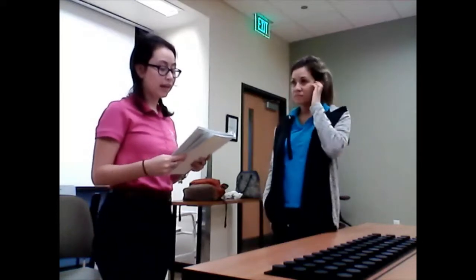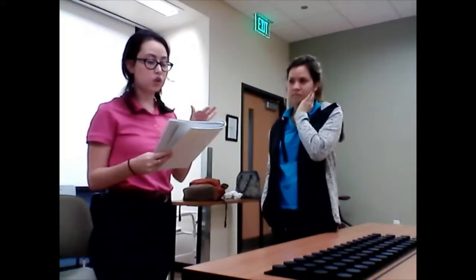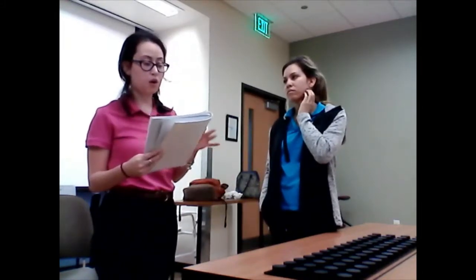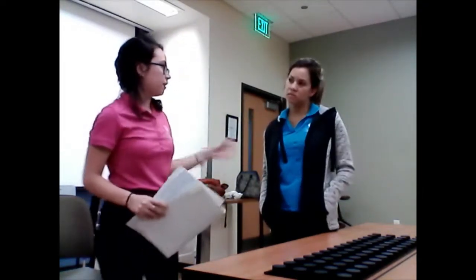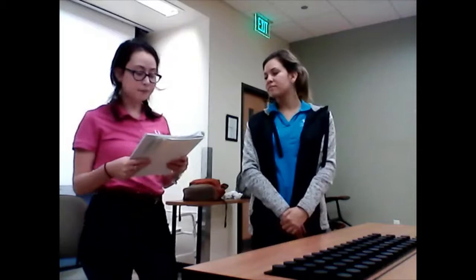The MMDT is an assessment that tests hand and arm dexterity and was initially created to job screen and job select potential employees in factories in the 1960s. This test requires the patient to be standing at a table that is 28 to 32 inches high.